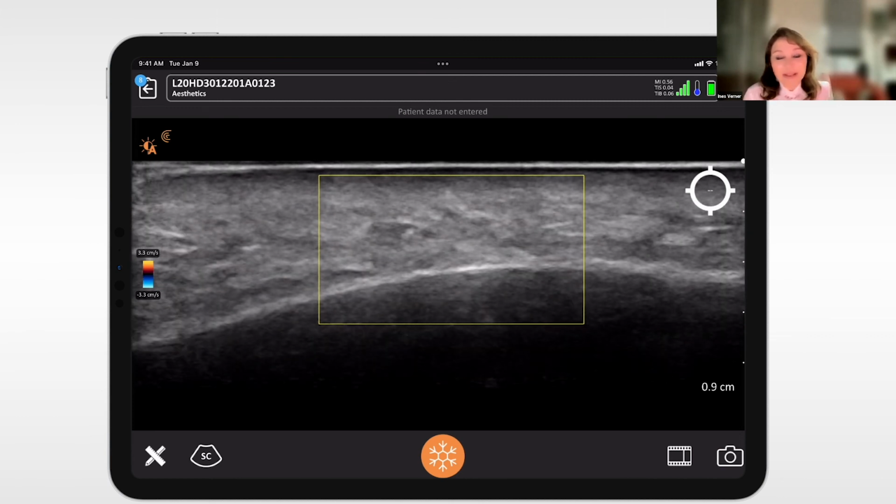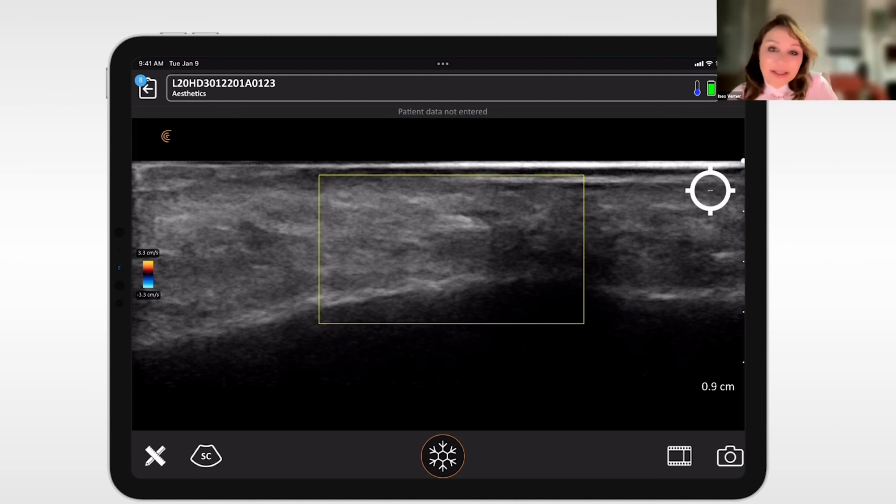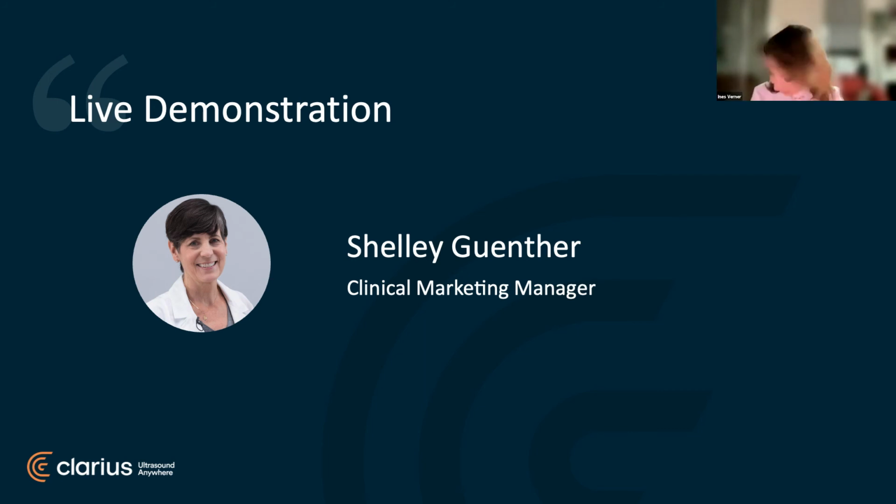But I think for safety, of course, really seeing this vessel now, knowing that it's a 2.7, and if you inject and just move away from there, we're not talking moving way away, right? We're just talking a couple of millimeters, and that's going to make all the difference in the world. Yeah, that's it. Excellent. Great. With a little practice, knowing what you're looking for, and having your machine settings optimized for doing aesthetics, I think it's definitely achievable by everyone. Yes, for sure, achievable by everyone.